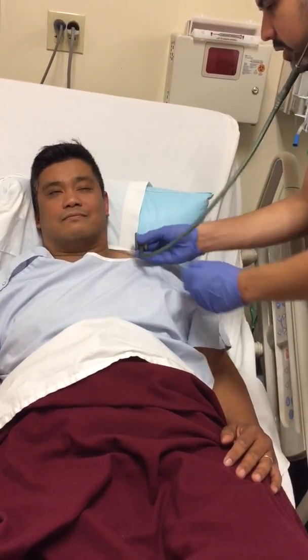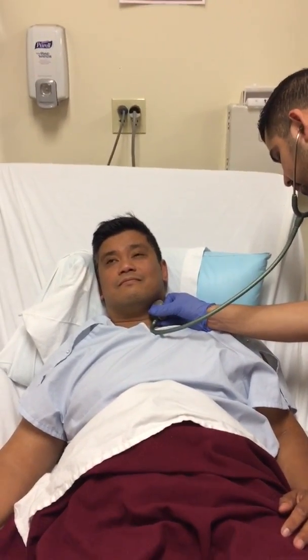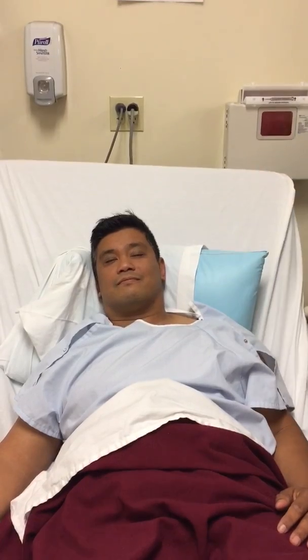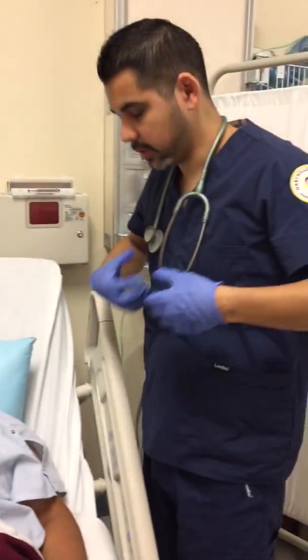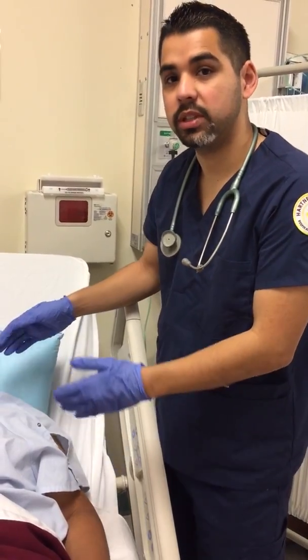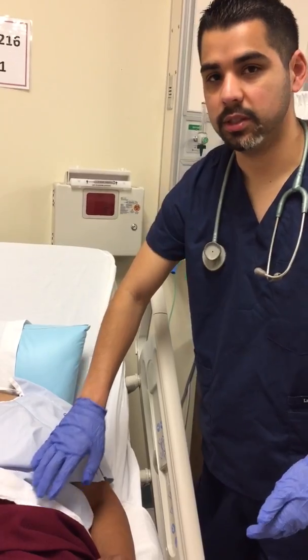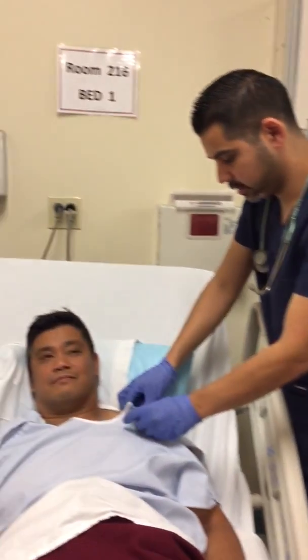Very good. Now I'm just gonna listen to your neck, okay? So take one more breath for me. All right, sounds really good. I listen to his neck just to see if there's any indication of any signs of stridor, and I can differentiate whether or not the wheezing is coming from his upper trachea or his lower airways and the bases of his lungs, okay?